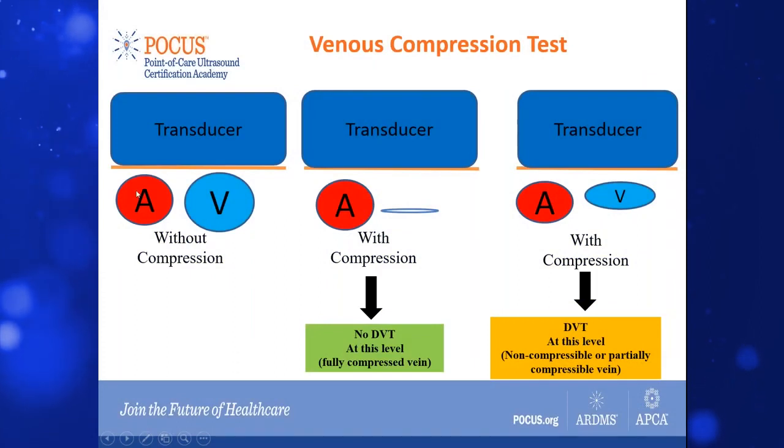The test is really very simple. You just find the vessel in question — the deep vein — and make sure they have the artery next to it, so we know that is a deep vein.